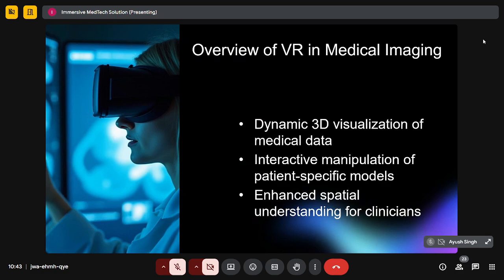Now, the software can also be used for a 3D complex data set. We can go directly to the specific point of defect and identify the defect, and there is a reduction in 3D printing. That means a reduction in cost by a huge margin, because when we do 3D printing, there's the material cost and the printing cost. A 3D printed medical model, for example a heart, usually takes around 12 to 24 hours to create a high fidelity model. And if we just need to check at what position a defect is, it's quite costly too. It costs around 10 to 15,000 just for a heart model to get printed.